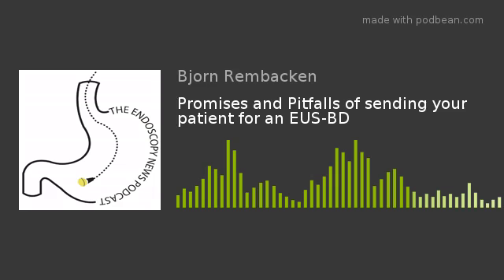In terms of the people who should be specifically performing these procedures themselves, myself and my colleague Dr. Huggett, we train around the country and internationally in these procedures, and we mandate that the person should be completely skilled and independent in diagnostic endosonography. They should have done at least 30 cysgastrostomy drainages before even considering to do a biliary drainage, and they obviously need to be in a centre which offers this level of support.